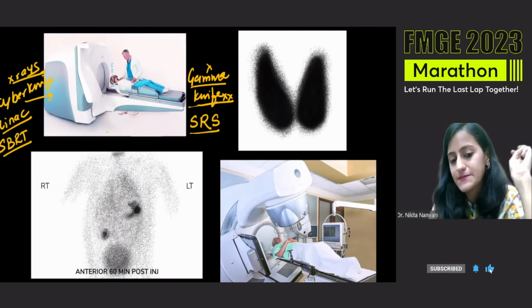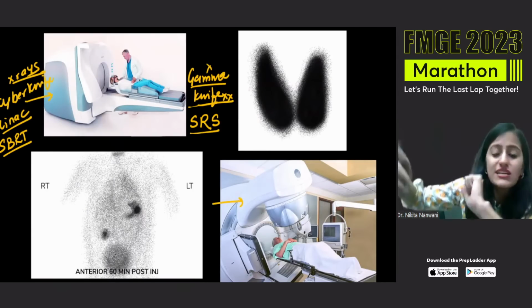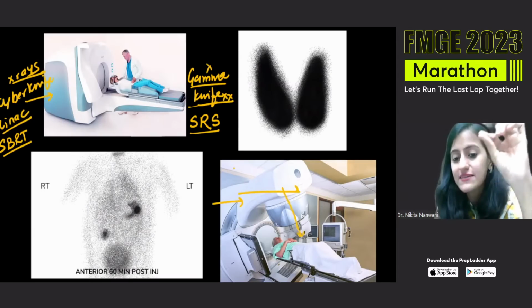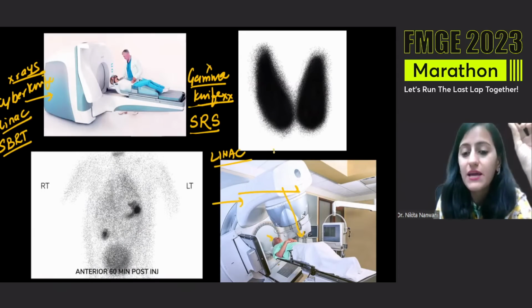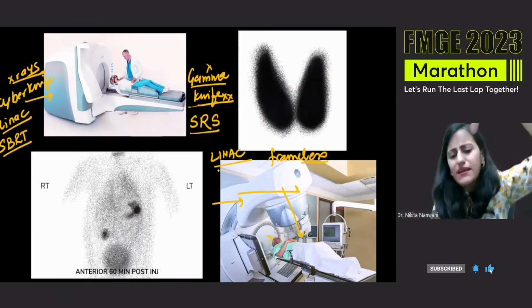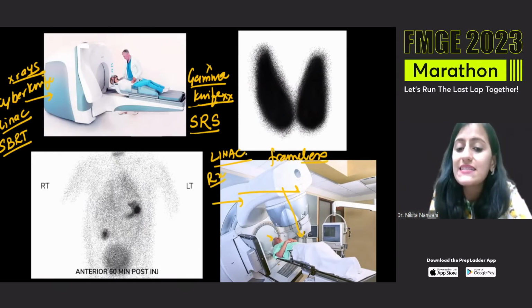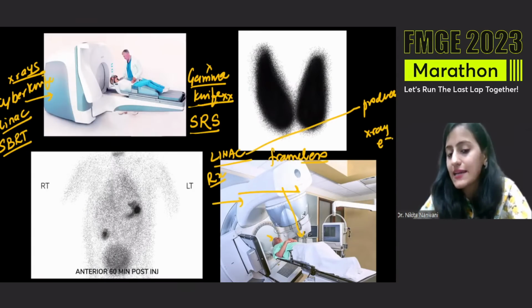Okay, which uses X-rays. This is what is this machine that you are seeing, which can rotate, right? So it can change the angle. There is this area here from where electrons and X-rays come. This is what is LINAC. We do not need a frame in LINAC. Linear accelerator, it is frameless. So remember that this is a LINAC coming like an overhead thing, which can rotate as well, used for treatment. Linear accelerator, what does LINAC produce? LINAC produces X-rays and electrons. Okay, it produces X-rays and electrons.